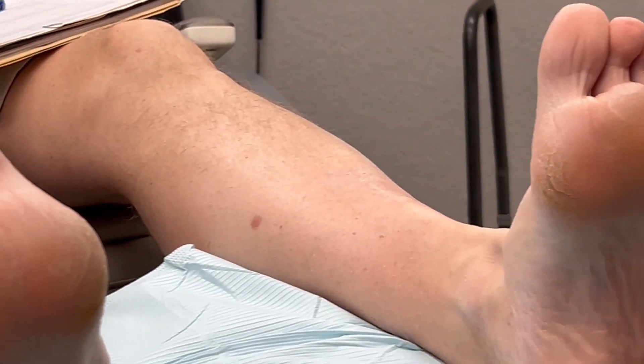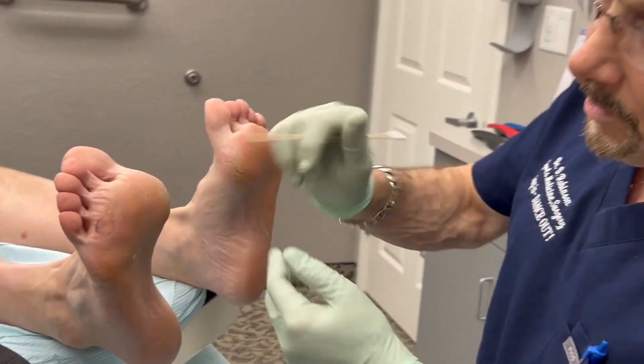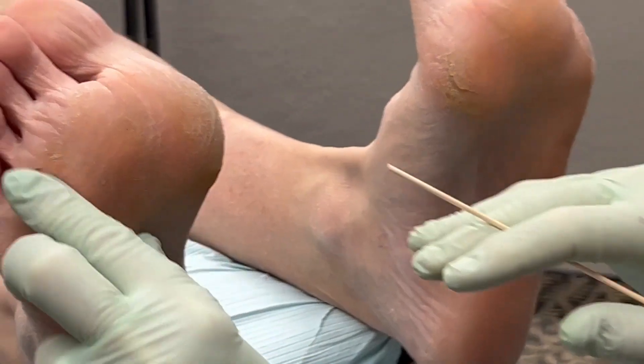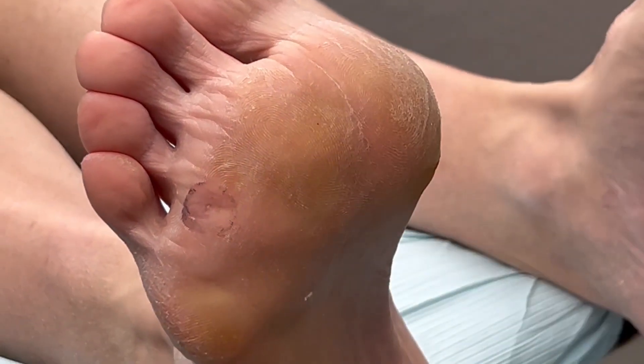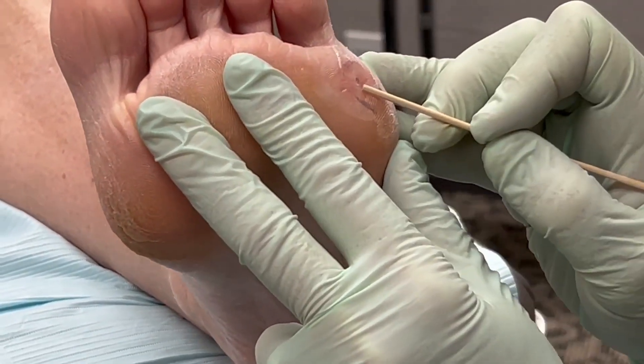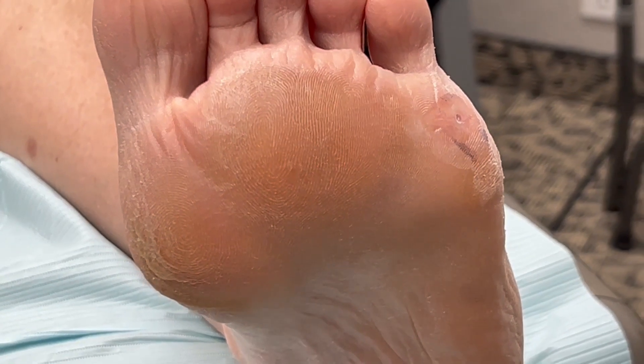So we're going to go ahead and do that now. I've now trimmed these down, paired them down — I used a scalpel. There's no blood, and then I burned it down with a burr. Now you can barely see the center of that on this one, and you can see a little bit more over here. What I've already done is going to give them significant pain relief, and now I'm going to apply this acid.